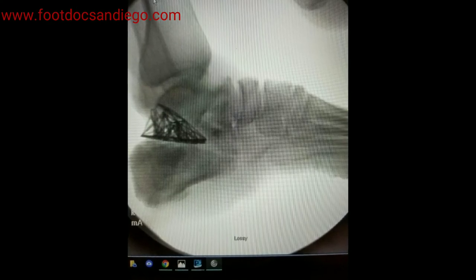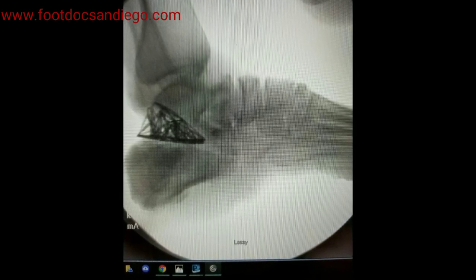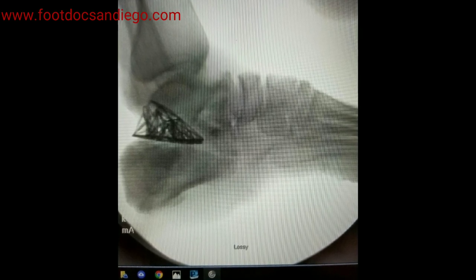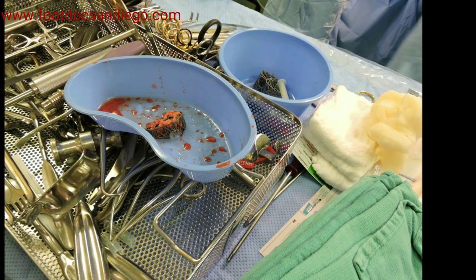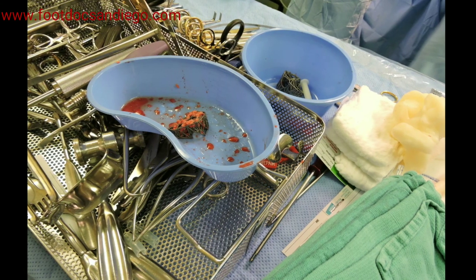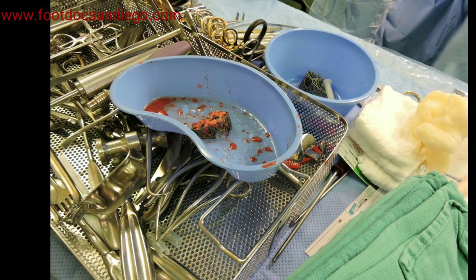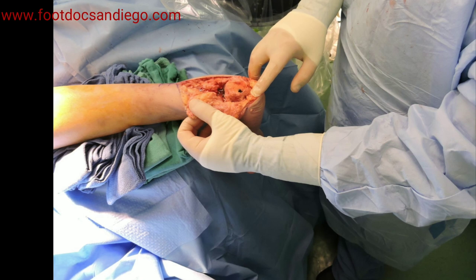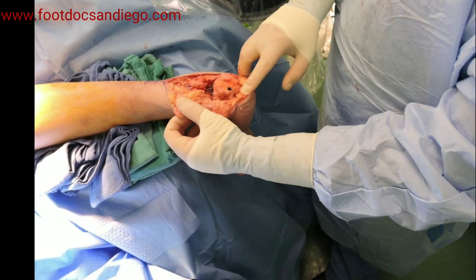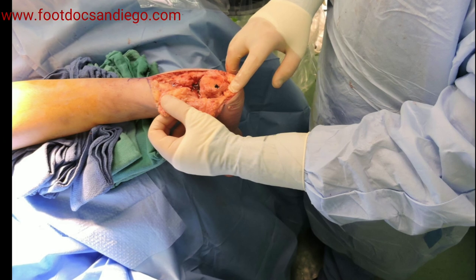Now you will see the implant in the right position with a realigned calcaneal inclination angle and the foot in a proper position. This is quite an amazing feat that can only be performed now with these new implants that are available. Here you can see again the implant prior to insertion, filled with the marrow. You will see the foot from the posterior approach with the screw going through the implant, crossing from the calcaneus through the 4web implant into the subtalar joint.